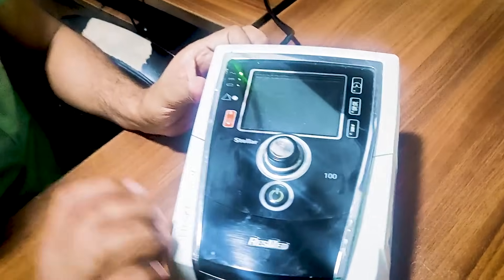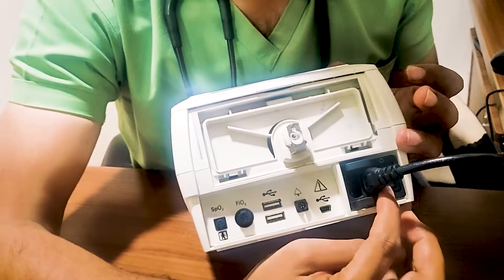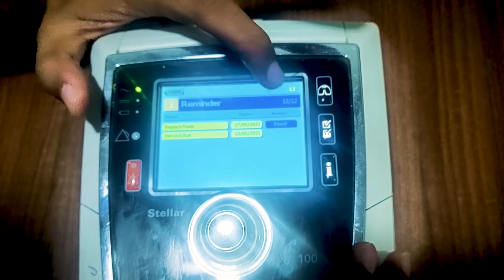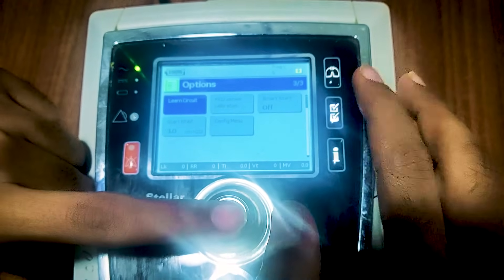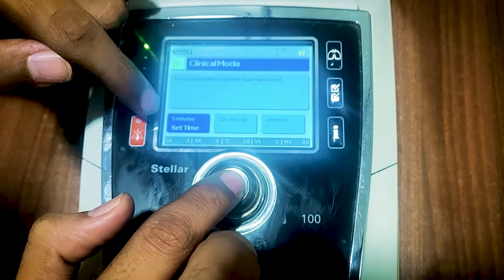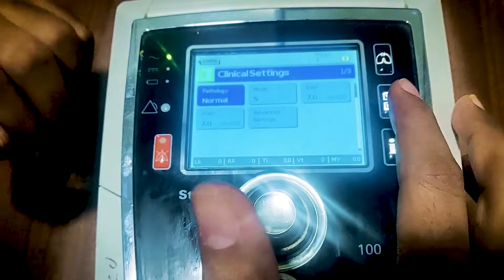Now, how to initiate and start. The BiPAP machine we use is a ResMed machine, specifically the Stellar. There are various machines available in the market, but I will demonstrate this particular one. As it is an electronic machine, you need to switch it on — there is a switch button at the back. Once switched on, the main screen appears. There is a lock button on the screen, so to change any settings you need to unlock it by pressing the second button and the main button together.